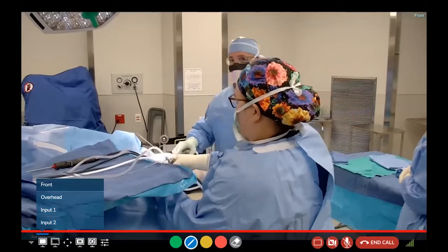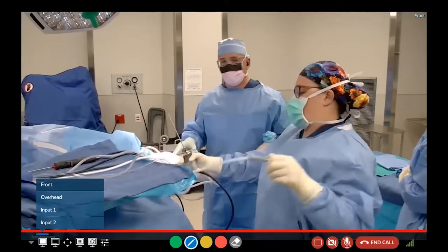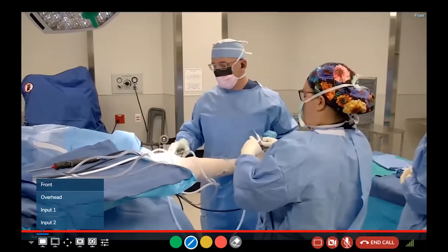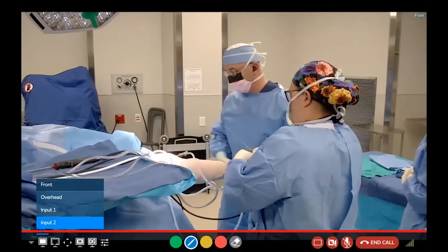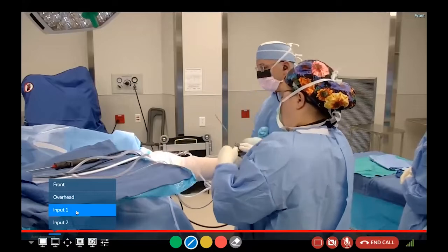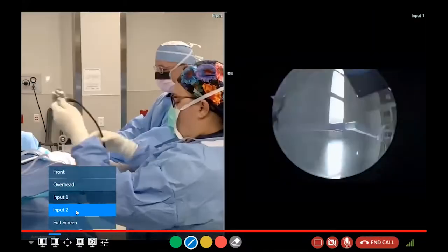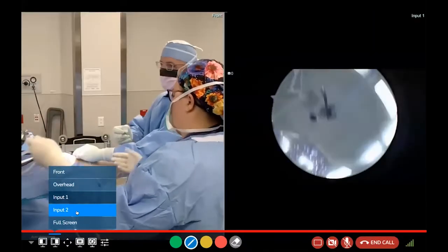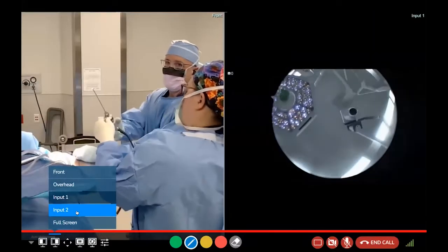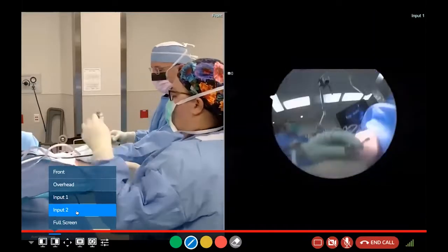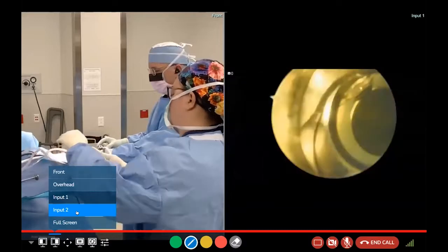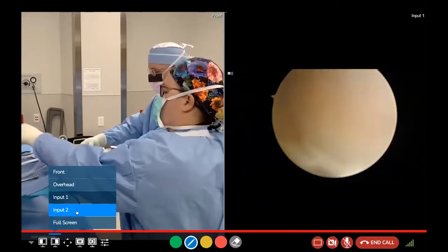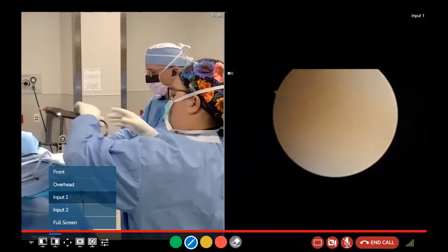I just made an incision there, and then I placed the arthroscope — actually the tube — inside underneath the kneecap. We'll pull up the image and you can see exactly what we're looking at here.